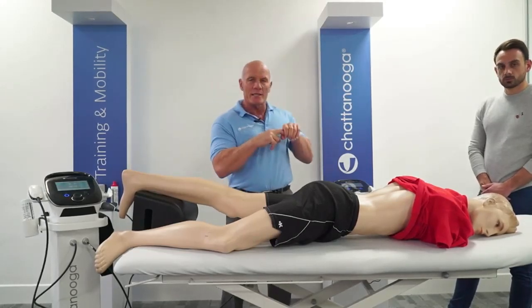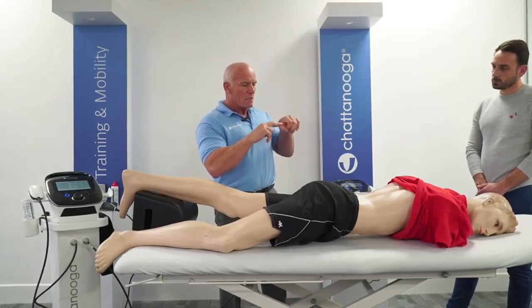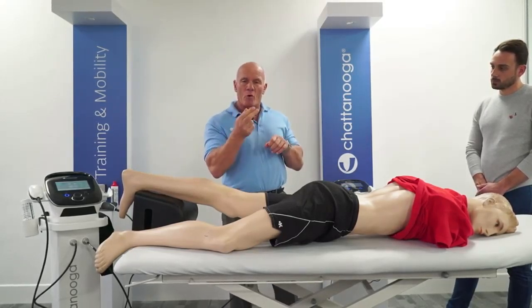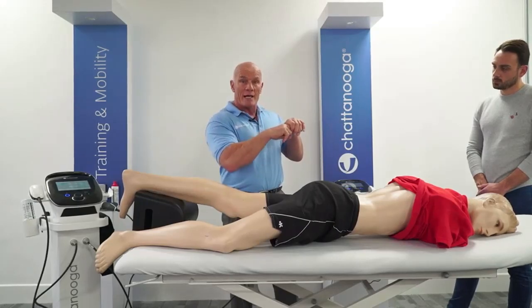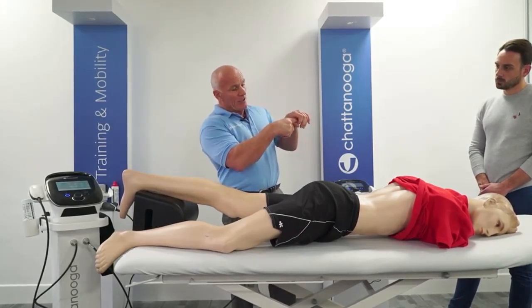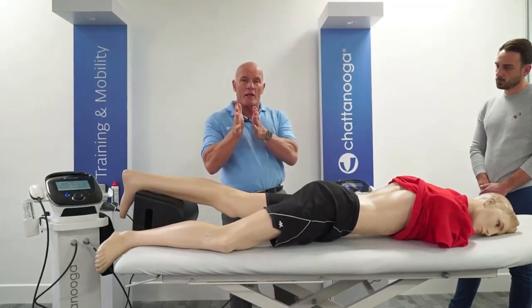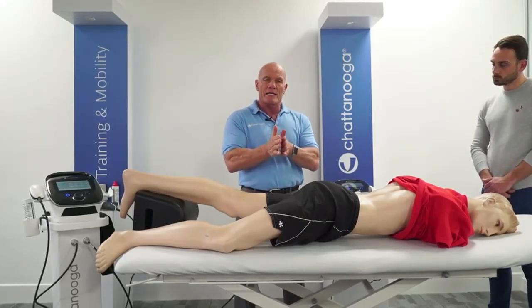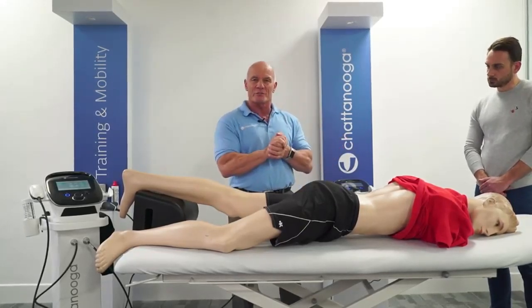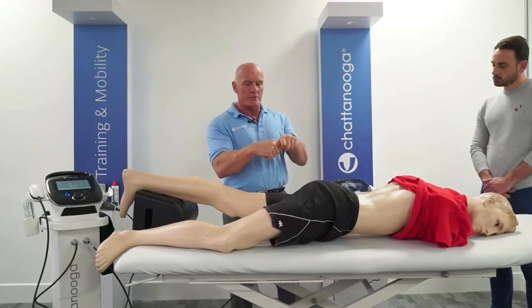And equally, I've got metal rubbing on metal. So if I've got a poor quality metal alloy that I'm using for my projectile, it's going to rub away, and then I'll end up with that space between. So over the life of the handpiece, we will get a gradual drop in the energy values being produced. Again, it's really important that we have good quality components which last.